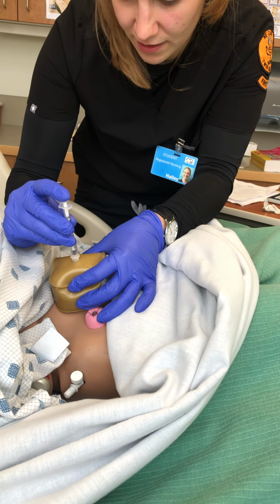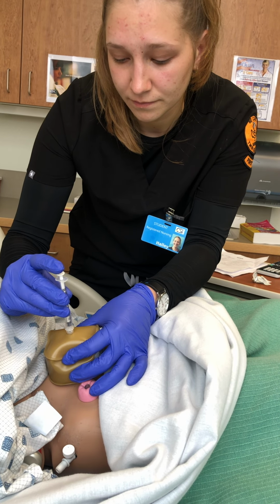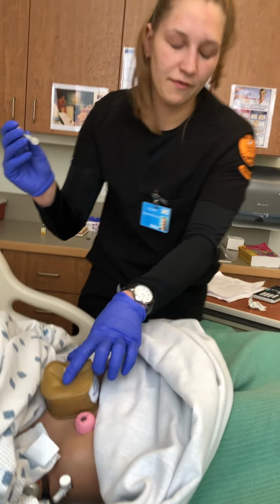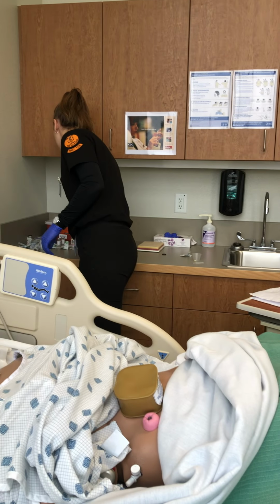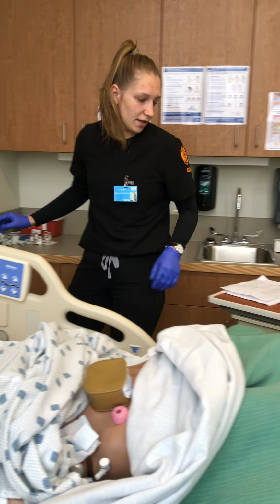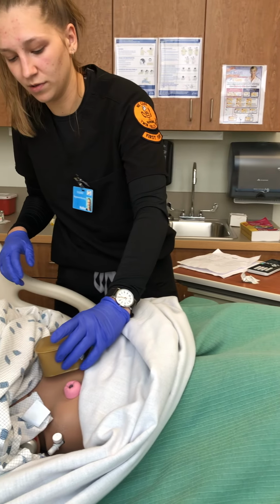I'm going to make sure to leave it in for 10 seconds. I'm going to pull it out, and I'm going to cover that with a Band-Aid and a cotton swab, which I don't have. I'm going to put that in the sharps container, make sure I get rid of it properly.